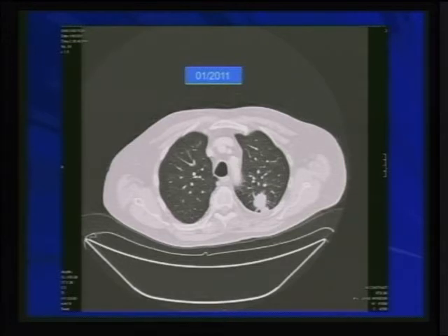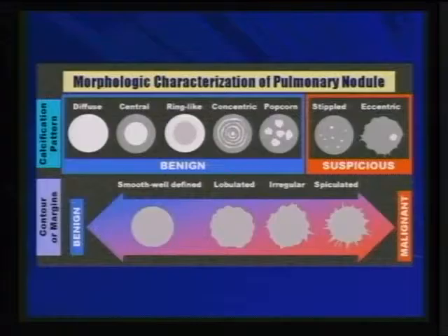So the point is to stress that there is a difficulty in trying to determine the nature of the lesion when it's very small. Those are indeterminate nodules, but we do have the ability to look at the growth and to look at prior studies, try to determine if the lesion has a potential malignancy or not. And again, I will elaborate that more.